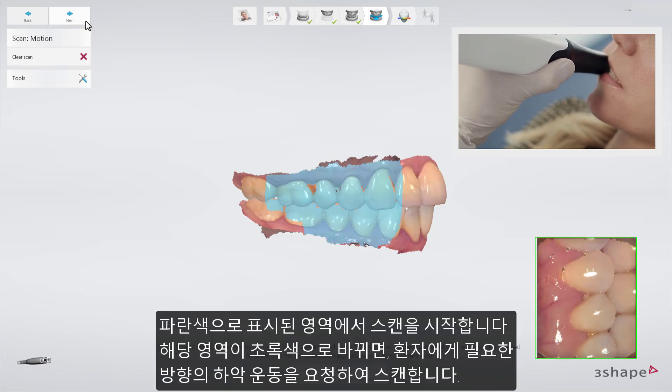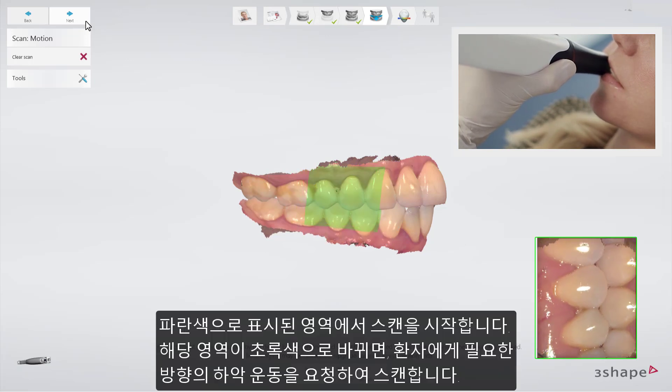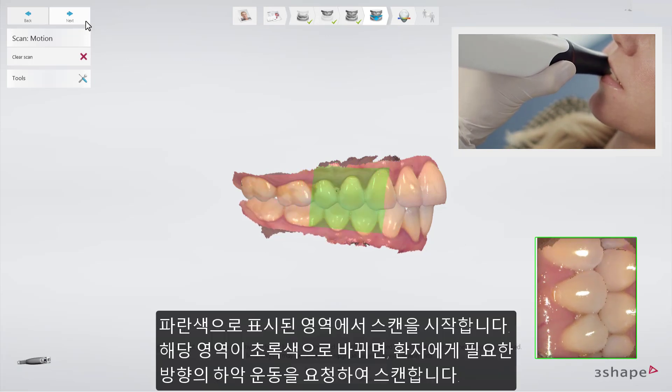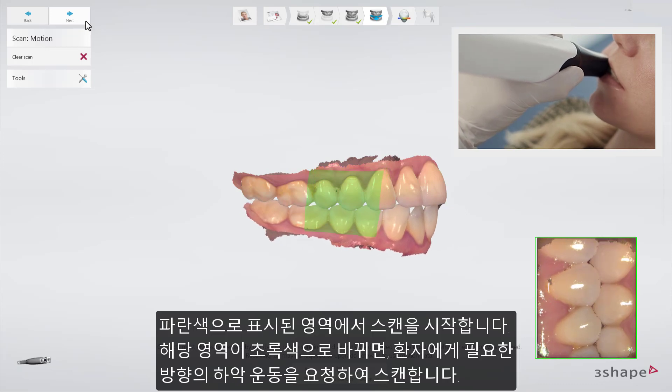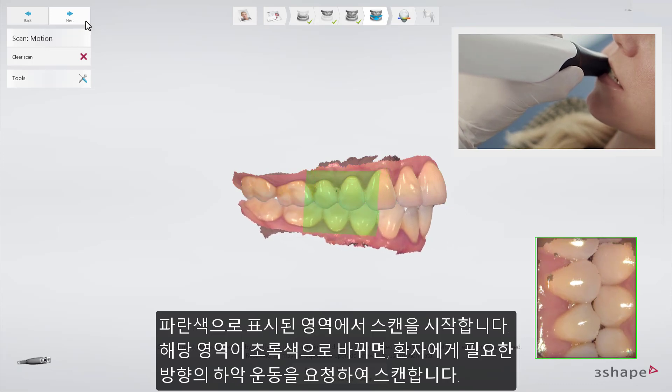Start scanning at the blue marked area. When the area turns green, instruct the patient to start grinding the teeth in the desired direction.